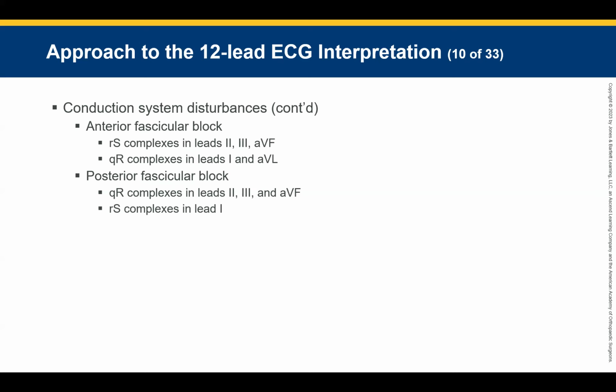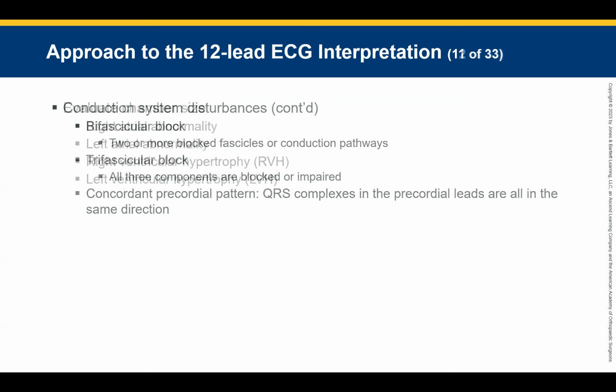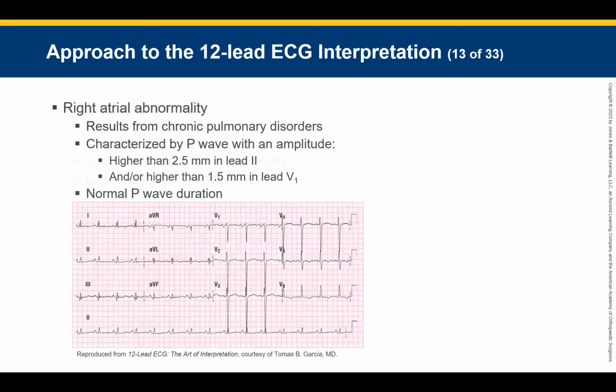So creepy. Anyway, we'll get into these little blocks probably next week, but really what you need to know about these little blocks is when we have a bundle branch, we have some of these other blocks that we haven't really talked about yet. These go along with axis deviation, which we haven't really talked about yet, and that's okay. The more of these little electrical blockages we have, the bigger the problem. But we'll get there. Don't freak out. All right.